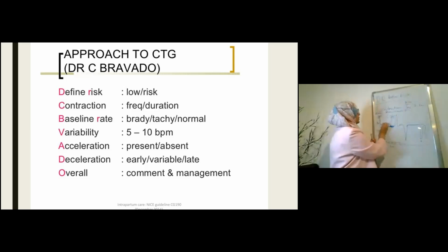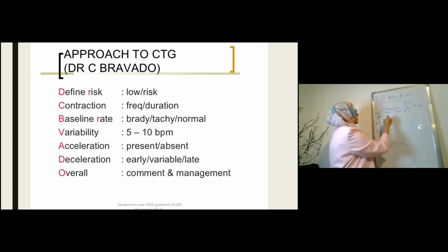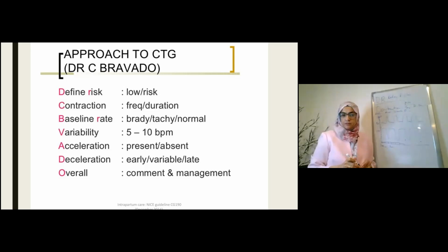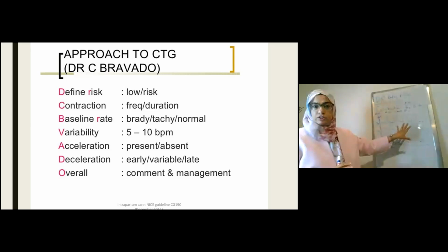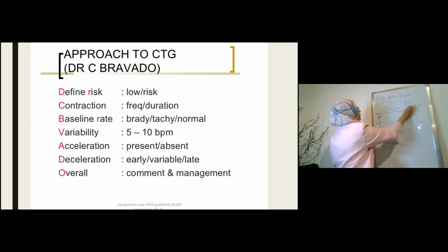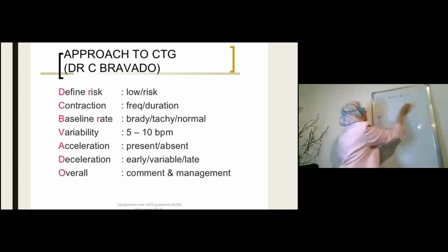So you don't really have to be a senior obstetrician and know all your obstetrics to tell me that this is a happy baby and this is a sad baby. So that is the most simple thing that I want you to know about a CTG. Okay, we don't like decelerations, we love accelerations, and we like a bit of variability. Okay, and that is how you will remember your Dr. C bravado, so you will never forget what you have to look for in these squiggly lines.